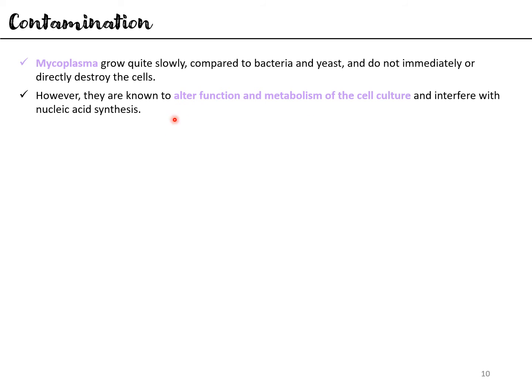However, they are known to alter the function and metabolism of the cell culture and interfere with nucleic acid synthesis. So this is even more dangerous than the previous one.